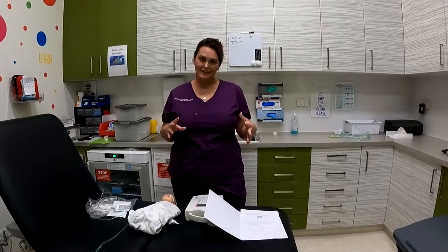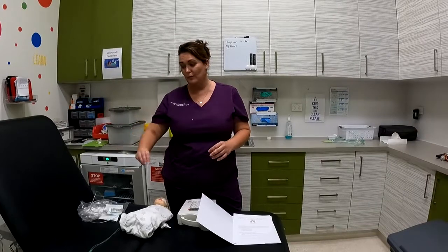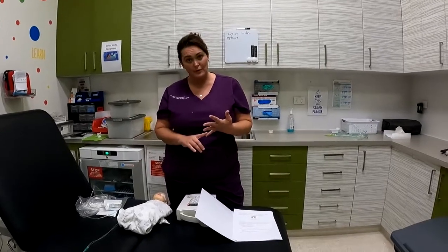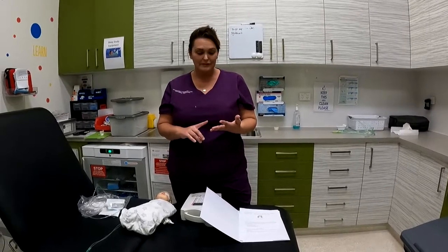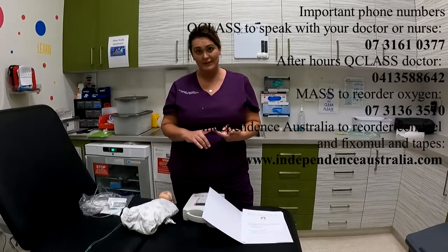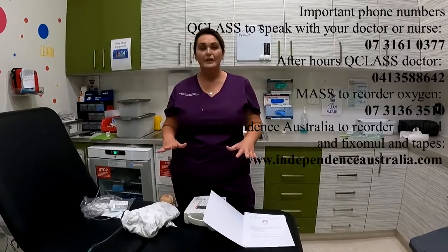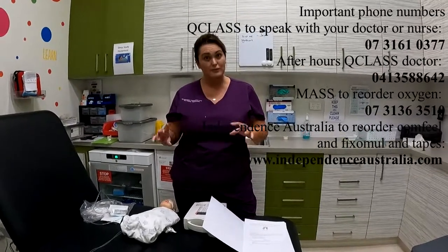So the take-home messages are, you should now have a bit of an understanding of how to check on your baby when you're at home, how to check that everything's working well with your oxygen and your regulators, how to dial up your oxygen, what to do if you're worried. So I really want you to understand what to do if you're concerned and who to call. So you can always call us, like I said, your GP, your paediatrician, the after hours number if you want to speak to one of our respiratory doctors. If you are concerned though, please have a very low threshold to getting them urgently reviewed. So make sure that you call an ambulance or take them to hospital if you're really concerned.